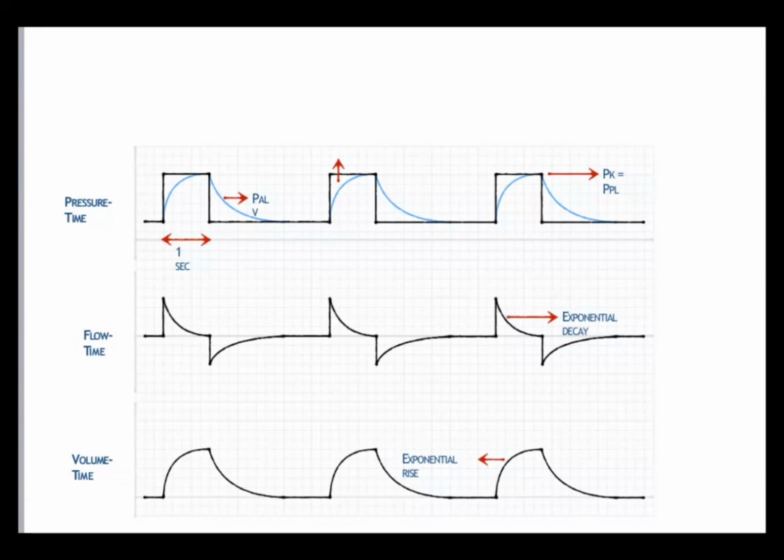And we'll start today with pressure control. I have an ideal pressure control tracing, which is from a PowerPoint presentation shared with me by my former attending and mentor, the person who really taught me mechanical ventilation, the ventilator course, Dr. Emil Owais. I appreciate his sharing this with me. This is all of his drawings and animations. So please respect and certainly teach and share, but realize that someone did put a lot of time into these really great drawings. So we're going to start with pressure control.